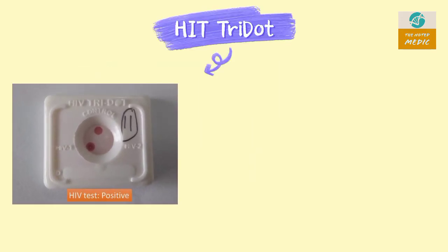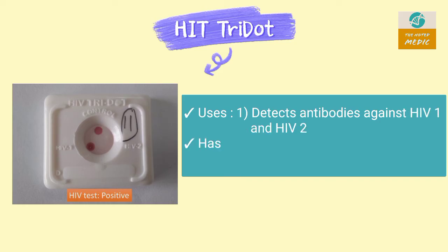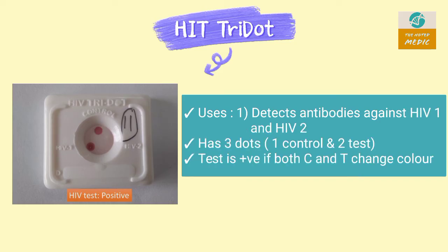This is an HIV tri-dot test. It detects antibodies against HIV-1 and HIV-2. It has 3 dots: 1 control dot and 2 test dots. The test is positive if 1 control dot and 1 test dot are colored.